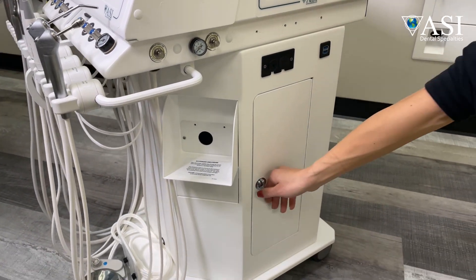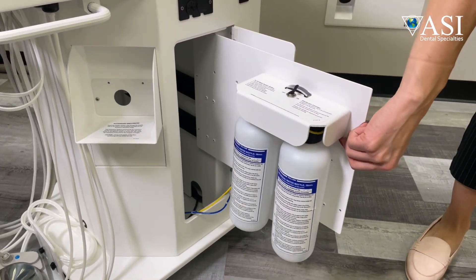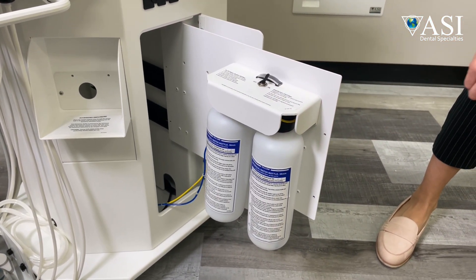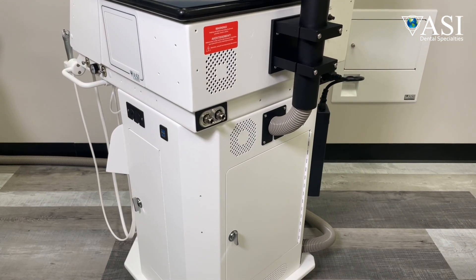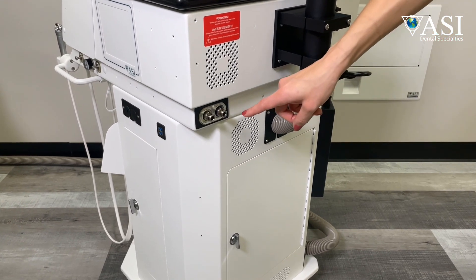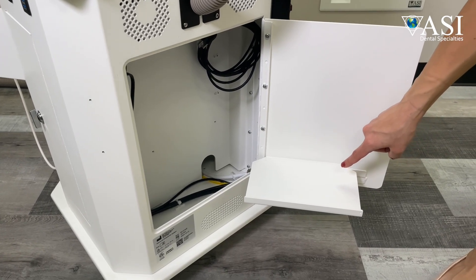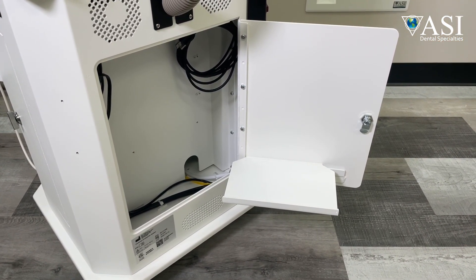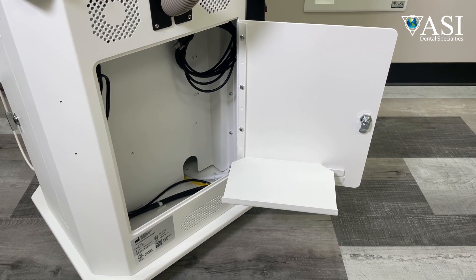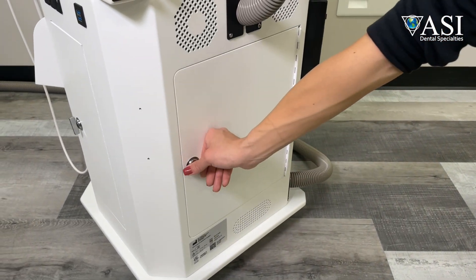The side door allows access to the self-contained water supply and optional irrigation system. On the back of the cart there are two quick connects, one for air and one for water, and a removable storage tray on the door. You can fit a micro computer like a form factor or small PC inside. There are also separate electrical outlets, and all data cables can run through the umbilical.